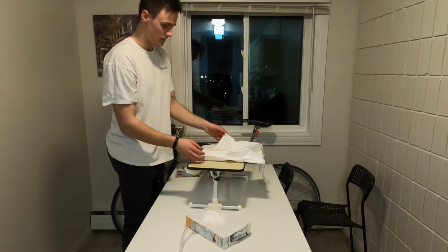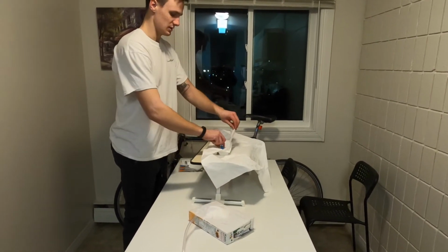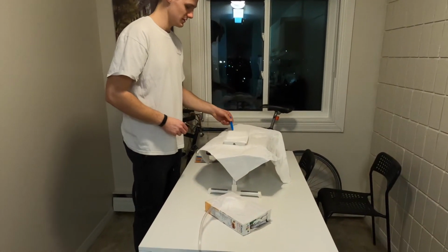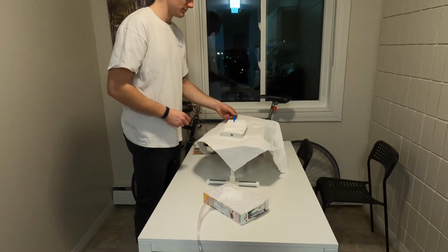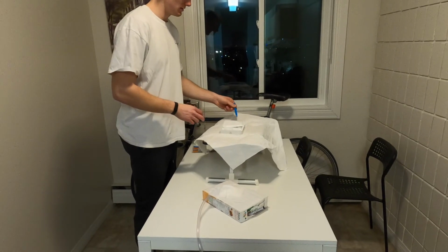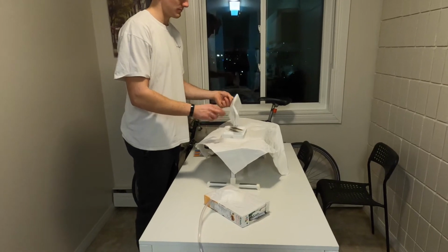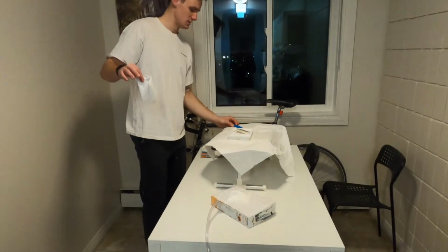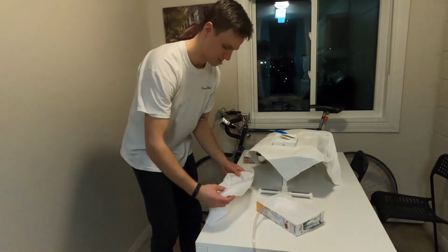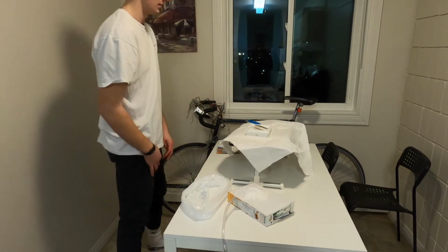So this table is kind of small. So my sterile field here is going to be a little smaller than it would be in real life, or in practice. So I'm not going to be using this, just drop this to the side, and then have a garbage bag here. I'm just going to set this up right beside the patient here for the old dressing. Set it up right there.